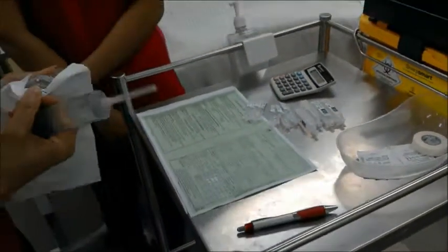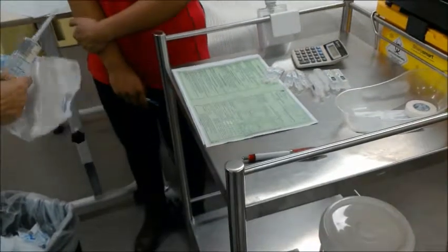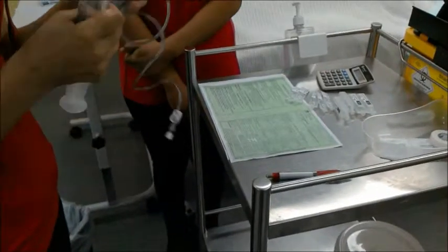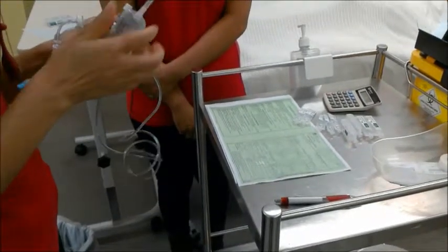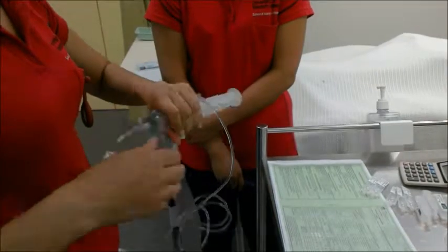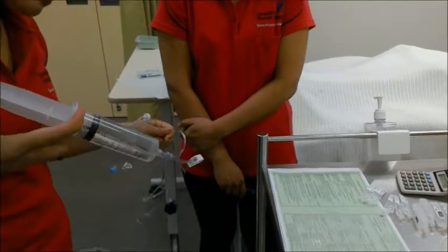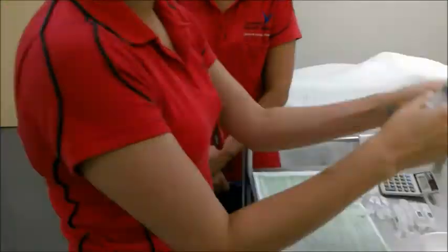Now I'm going to just prime my line. Okay, my line has been primed.